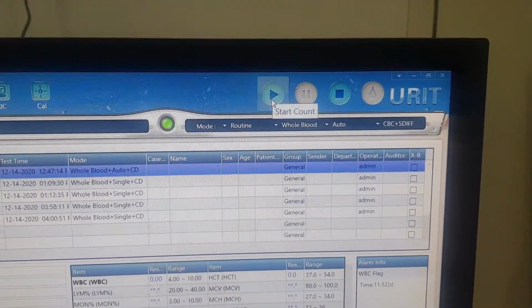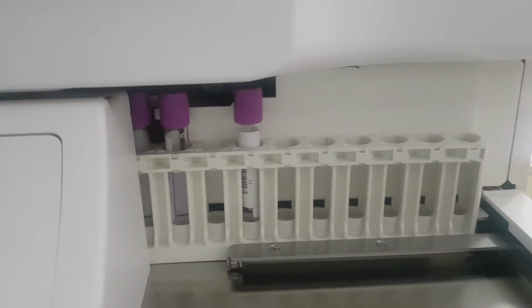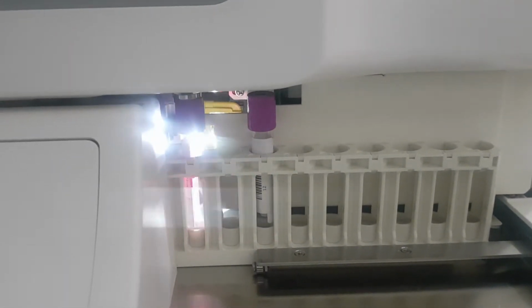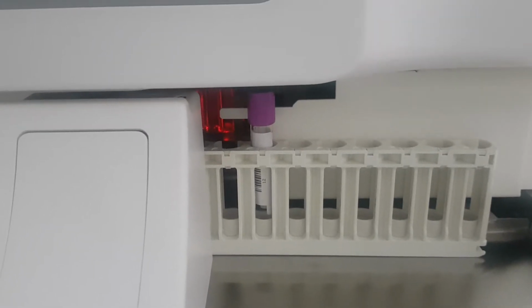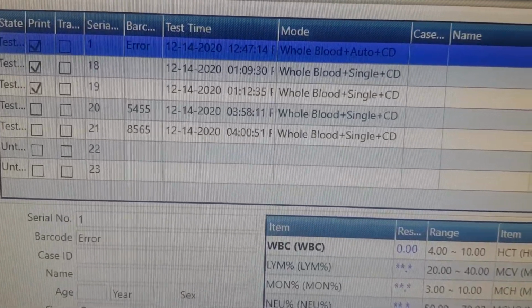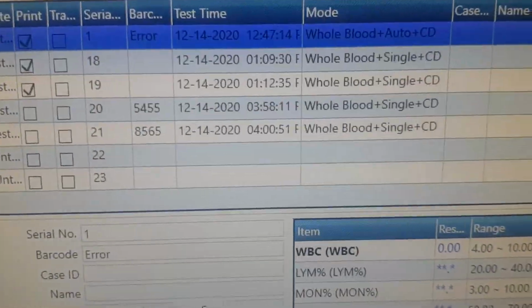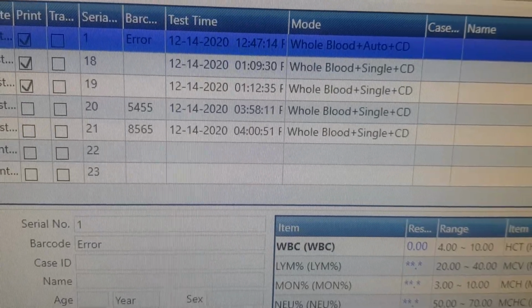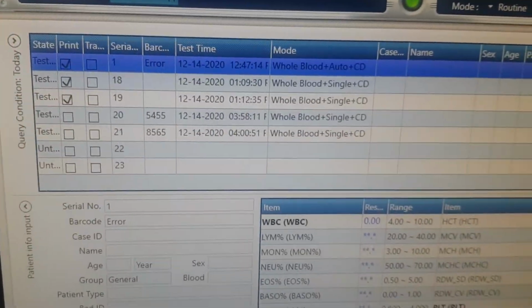So in auto mode, we press start, and let's see, the analyzer is working with one position empty. Number 3 position is empty, no tube is there. So here we already run 2 samples, serial number 20 and serial number 21 in manual mode, in start position, and as we input the barcode ID for those 2 serial number, it analyzes the sample and it gives as we wanted. Now we are waiting for the rack result.